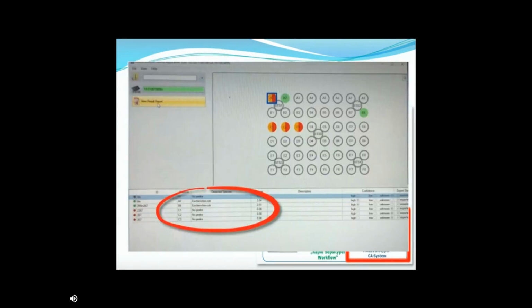Okay. So here's a case where we ran the Sepsityper, and as you can see, it says no peaks, and under the score, it says 0.00. So this would be something where this was the rapid Sepsityper, so there was no extraction. We would do the extraction on it, and then we would see if we could get those numbers higher. If we can't, then this is a case where we would put it on our molecular instrument and get the identification off of our molecular instrument.